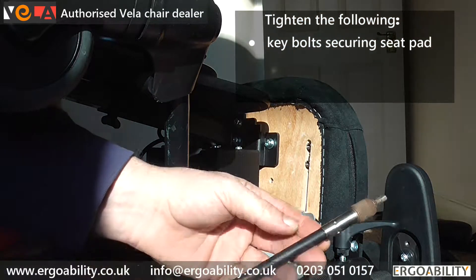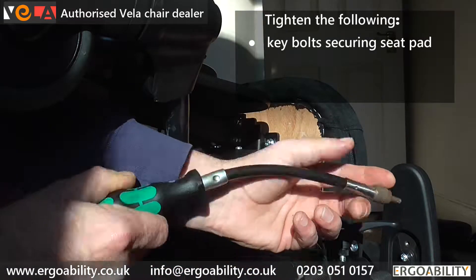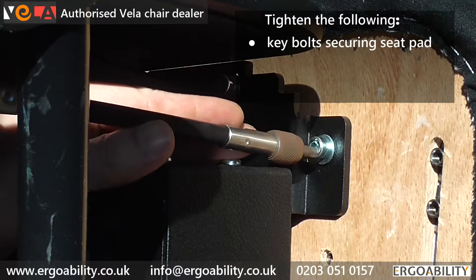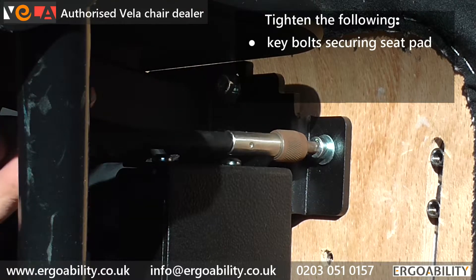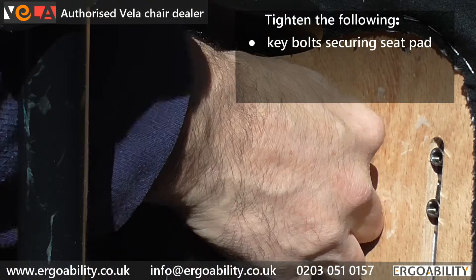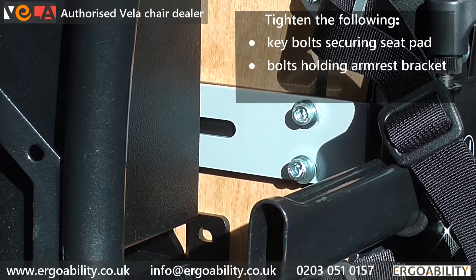Ideally use a hex driver with a flexible shaft as some of these bolts can be tricky to access. Also tighten the bolts holding on the armrest bracket.